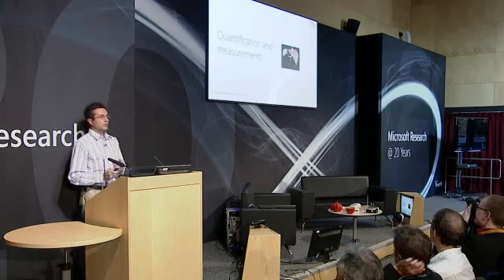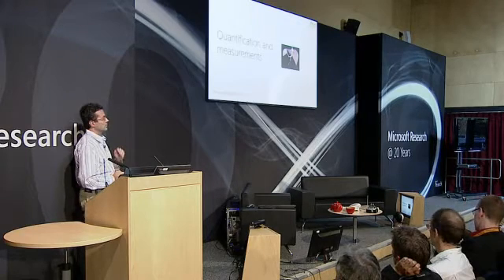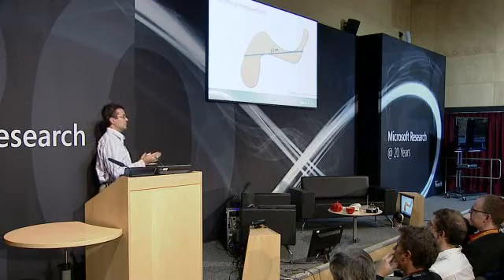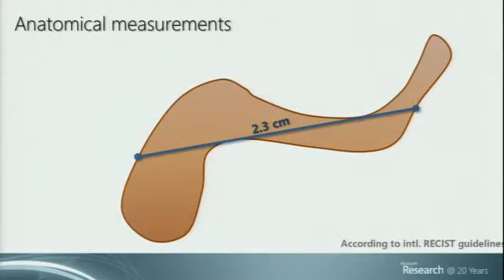So very quickly moving to the second part of the talk, I wanted to mention a few things around the area of measuring. So for the less fortunate people that suffer from, say, tumors or other anomalies, like it could be an aneurysm or other lesions, you might know that an oncologist would tend to come up with measurements of that tumor, trying to assess whether the lesion has grown or has shrunk with respect to the previous week, whether the therapy is working or not. But unfortunately, the measurement techniques that they use are very, very crude, and everybody knows this.